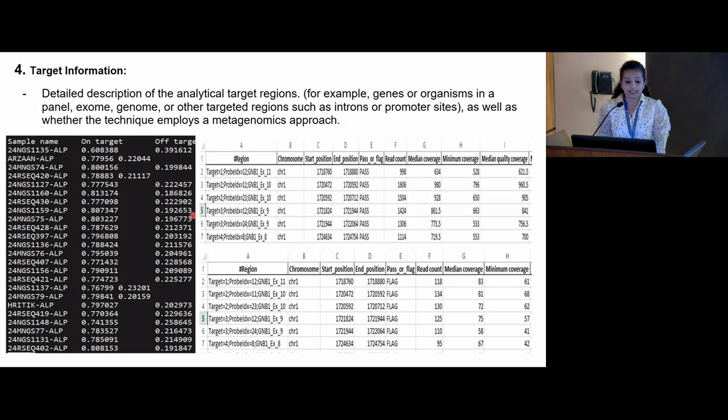on-target information, like a detailed description of the analytical target region, should be maintained properly. If there are off-target regions that are sequenced more than on-target regions, it will lead to lesser coverage, which will lead to fewer VAF regions, and that will lead to missing mutations that are very crucial and which have lesser VAF. If you want a great median coverage, for our lab generally it is 200x, greater than 150x.